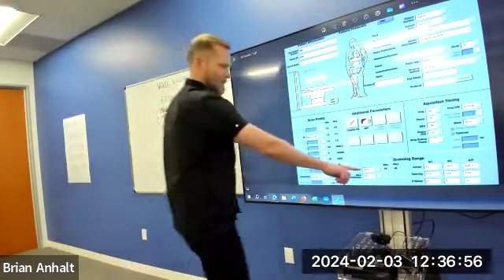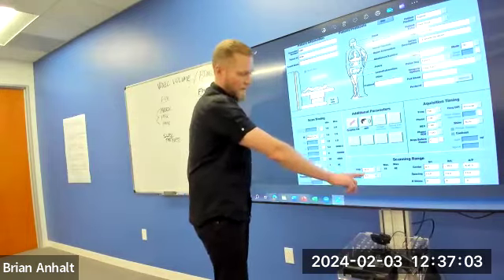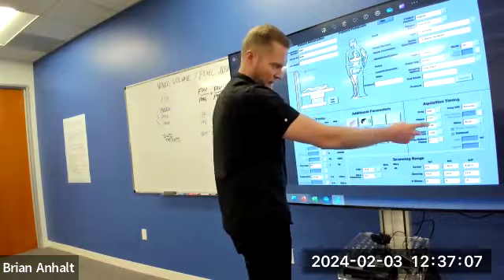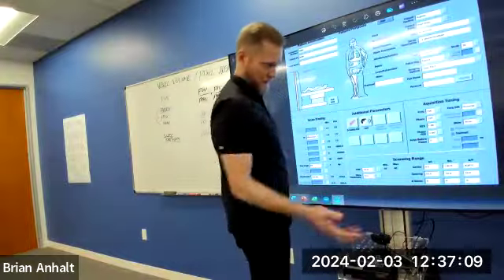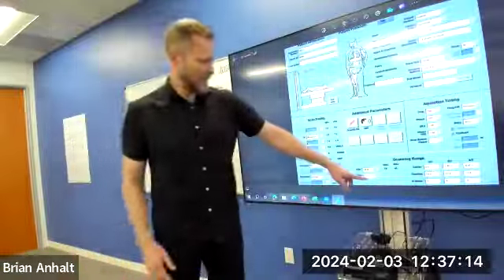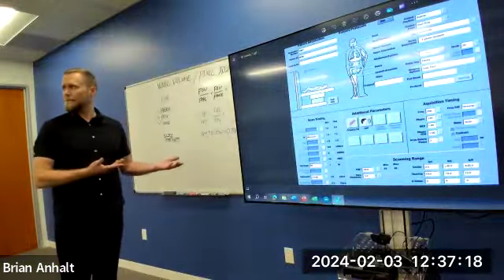Let me show you again. Field of view 240, or sorry, 24, it's in centimeters, so it's 240 millimeters. Frequency matrix 256, phase matrix 128. So we have anisotropic voxels and a slice thickness of 5. We could do the math and figure out what our voxel volume is here, right? If we wanted to.